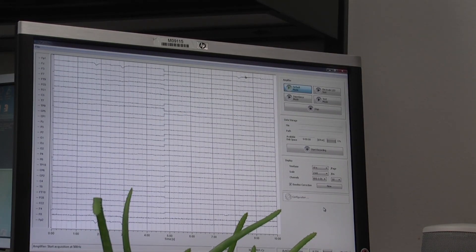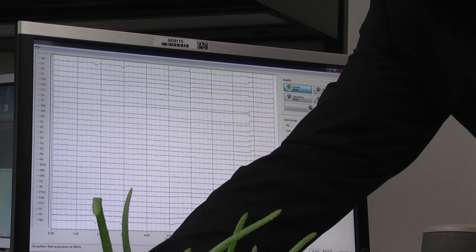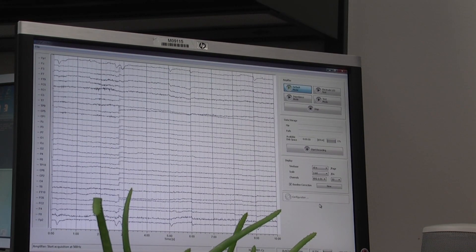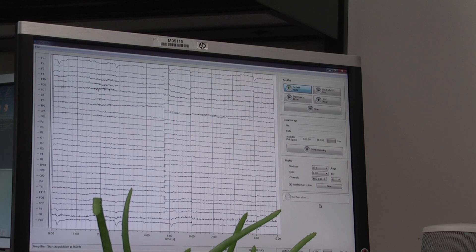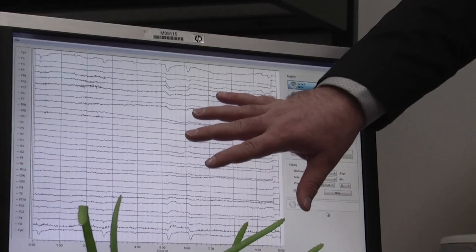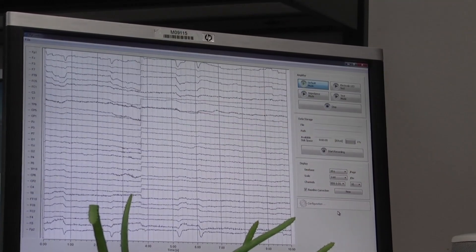So the first thing I'm going to have you do, zoom in one more. There we go. I want to show a couple of standard things that happen in an EEG. So when we're looking at an EEG, there are certain types of things that we know always happen. Allie, the first thing I want you to do is shake your head back and forth from side to side.